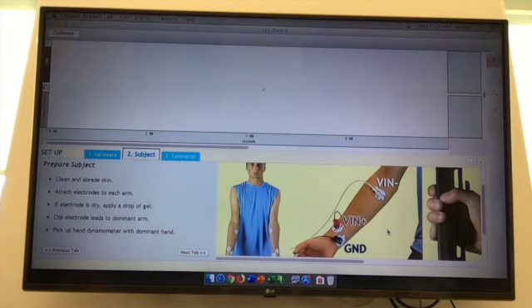By firing messages through those nerve endings, we're going to be able to measure that electrical activity in the actual muscles themselves. If you have more muscle activity happening, that probably means that you have more muscle fibers being activated. So we'll see how that looks. We're going to use something called a hand dynamometer today, and that's what this black thing is.